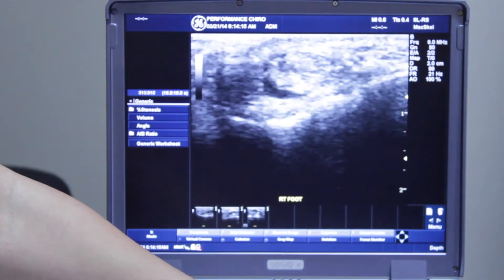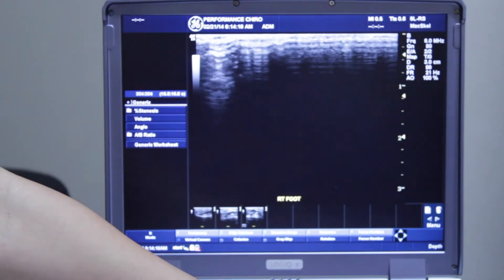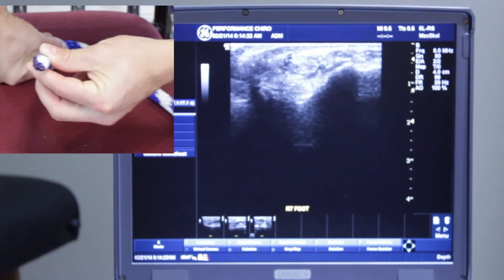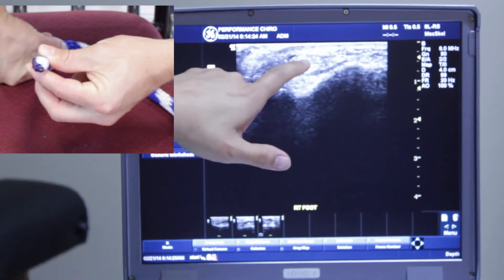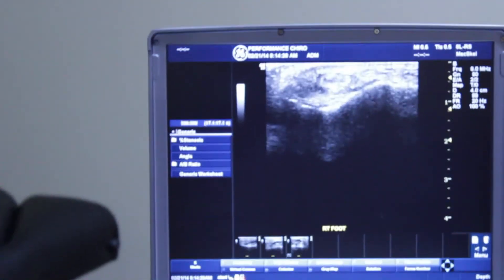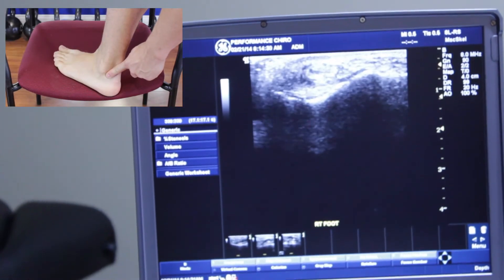In this cross-sectional view we'll be able to see synovial thickening. The two tendons — the peroneus longus and brevis — are stacked, like one and two right on top of each other. You can already see the black area indicating inflammation.